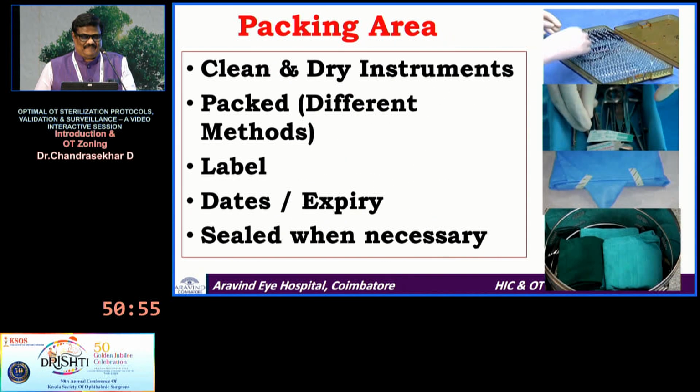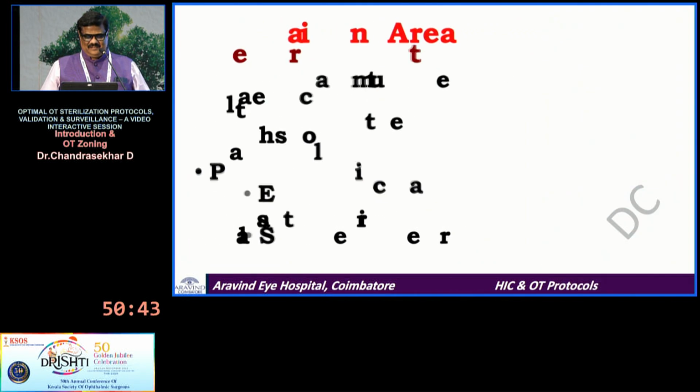Then you have the packing. After cleaning, you do the packing there. There are a number of ways of packing, not like the older ways, even though we still do this bin packing, but there are specific packings for each set, which Rajiv will show.